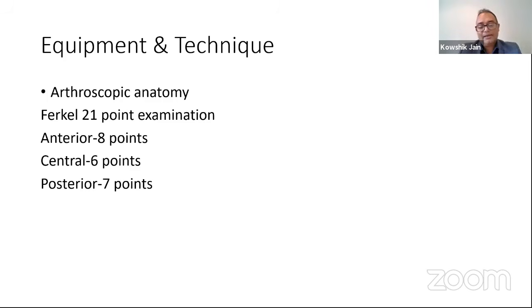If you see this, that confirms that you are in the ankle joint. Once you've confirmed that you're in the ankle joint, insert the remaining 10 mils of saline. So 20 mils of saline in the ankle joint. The purpose of doing this is to avoid iatrogenic articular cartilage damage when you put your trocar in, okay?